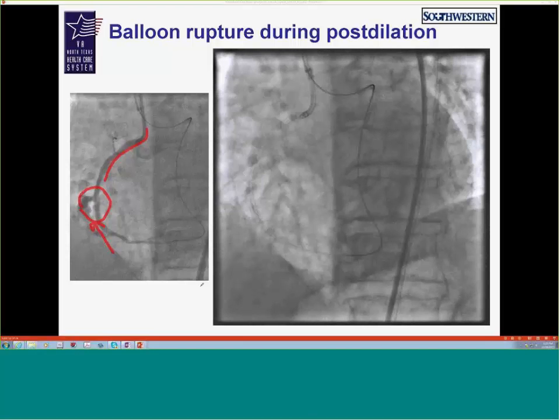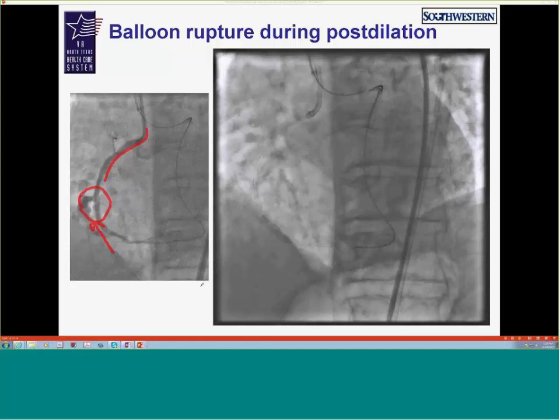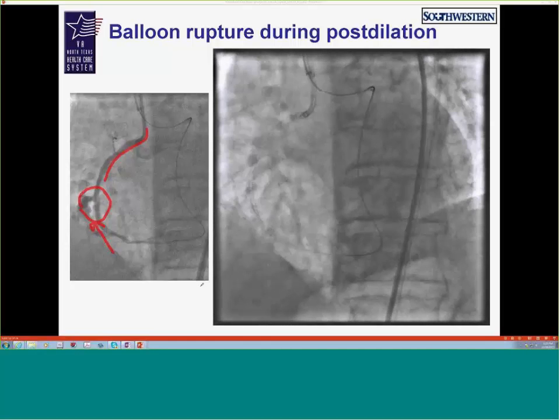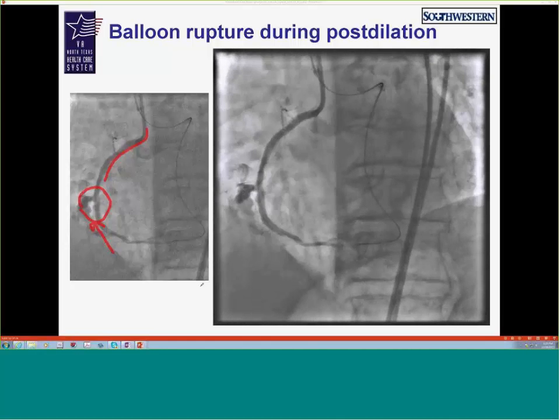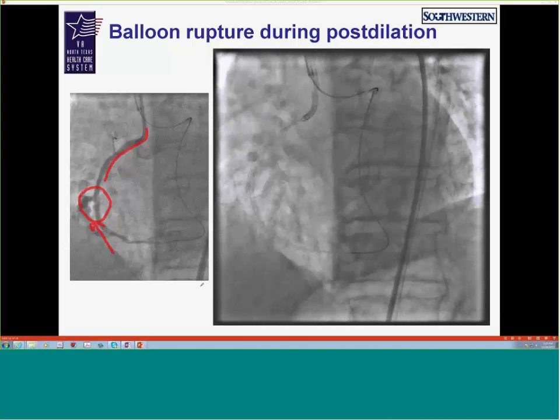He's stable. No, he's having some discomfort, but blood pressure is holding. Did it cross your mind, I mean, it looks like a large perforation that even with the balloon inflation, it probably won't seal completely. Did it cross your mind to just go in with a cover stent and fix it? Yeah, so that's the first thing we want to do.